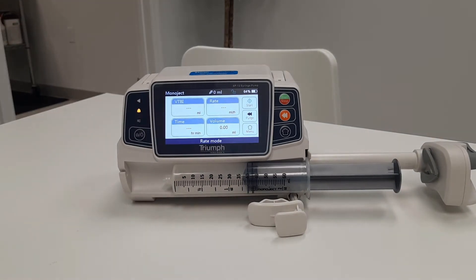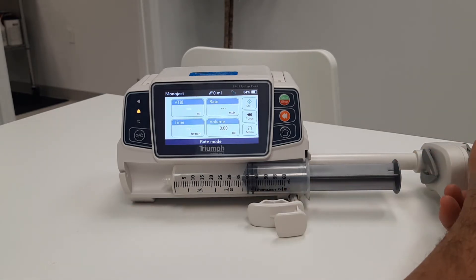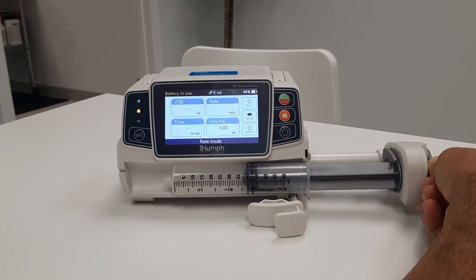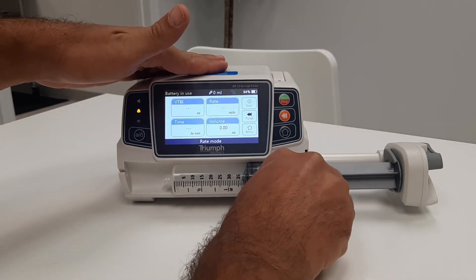This is an important step because if you don't have the flange seated correctly, the pump may not recognize the correct size of syringe. Next, depress the plunger handle and secure it on the plunger. Make sure that the plunger holder is all the way up against the plunger on the syringe. Rotate the barrel clamp to secure the syringe barrel.